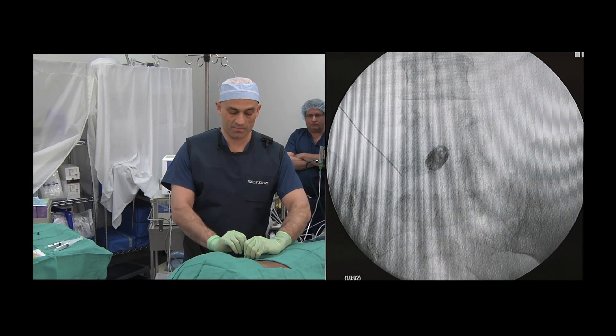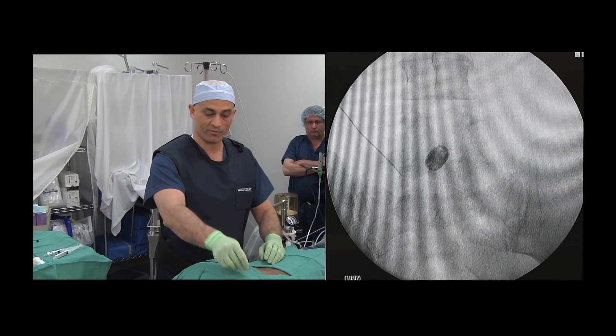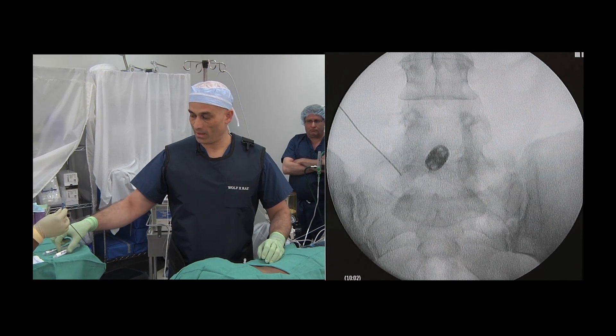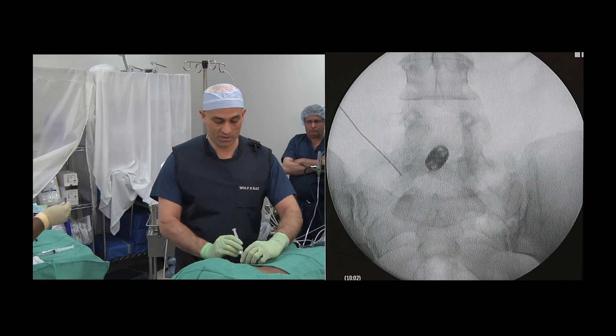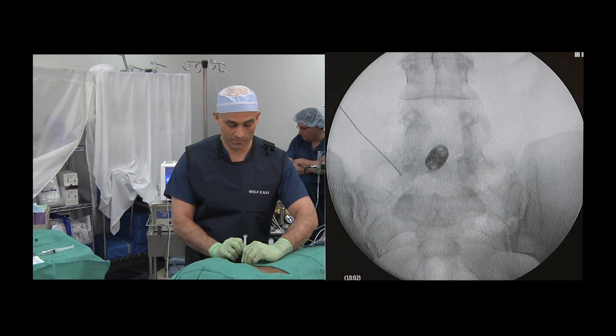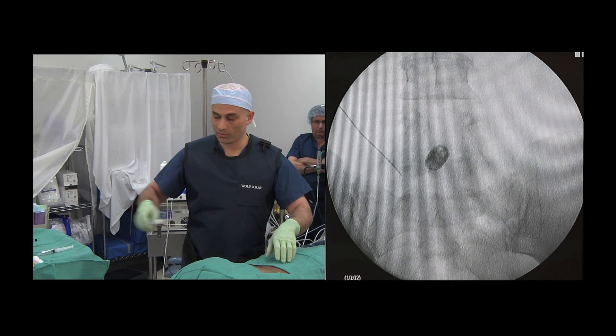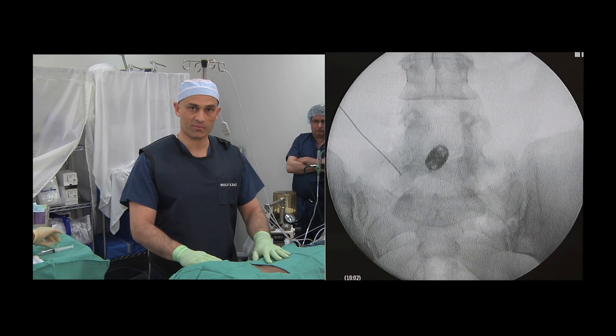The lesion has been generated. The stimulating probe is removed from the needle, and a steroid solution is injected through the needle into the area for post-operative relief. The needle is withdrawn from the patient's back and this concludes the procedure.